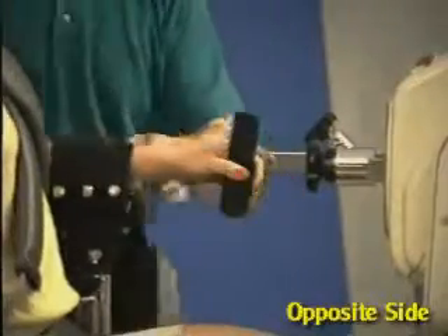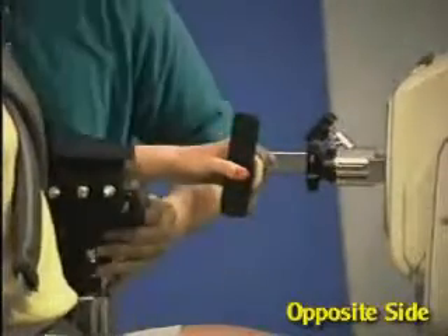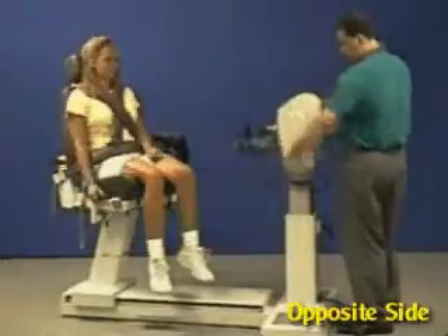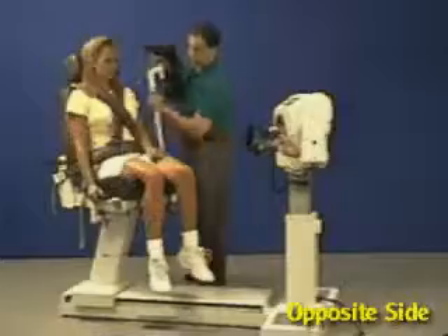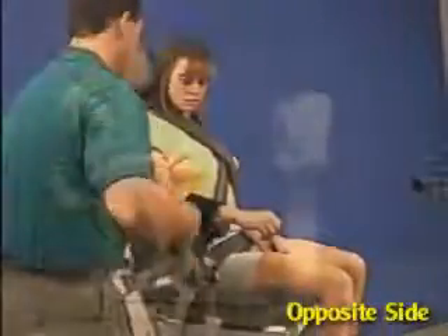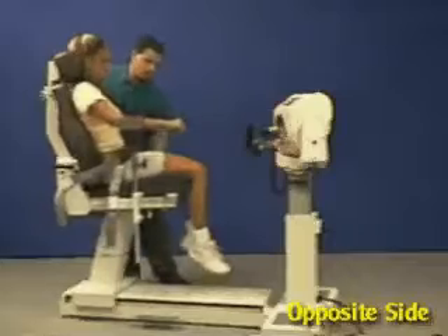For the opposite side, unstrap arm and move patient back. Rotate dynamometer to opposite 30 degrees. Move limb support to other side of chair and secure arm. Rotate chair to opposite 60 degree setting.